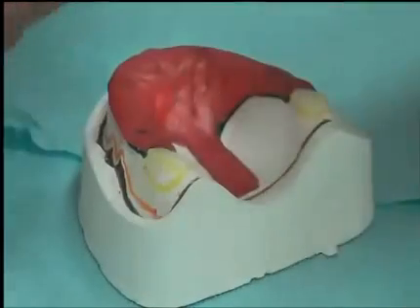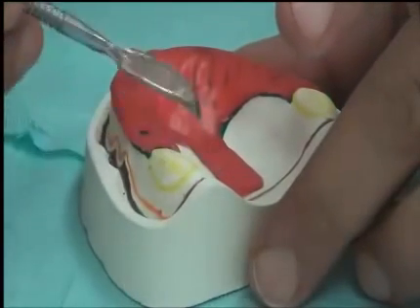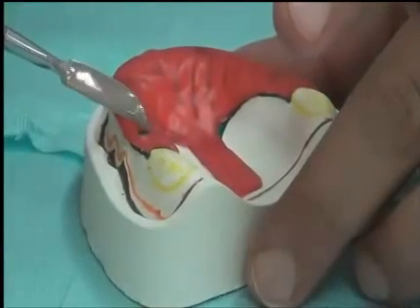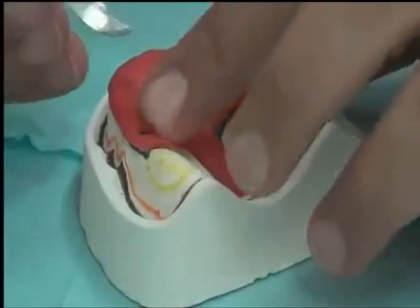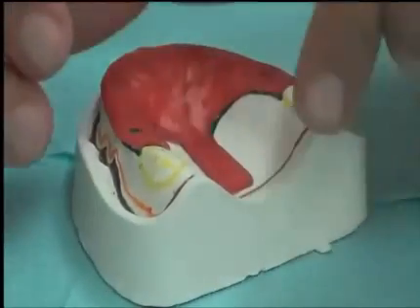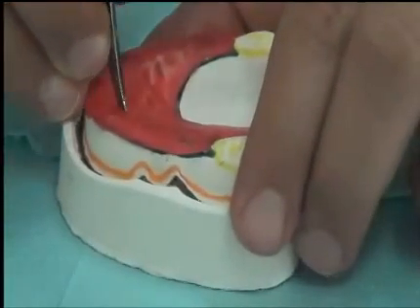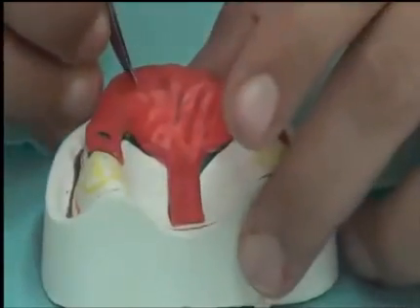And one in the canine area. So, the tray material, as it's touching the support areas, it will touch just over here to maintain the space. If these stoppers are not there, the tray might tilt while taking the impression and we lose the space we have formulated or made in this cast.